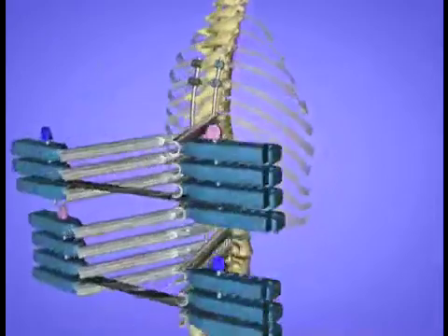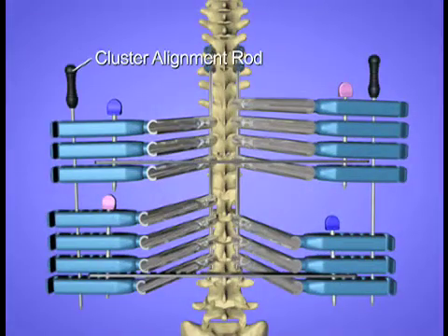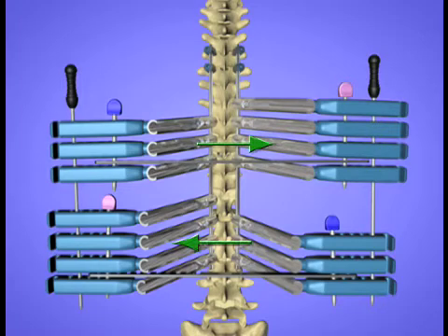With desired axial plane correction achieved, cluster alignment rods are added to hold the correction in place. Holding a slight overcorrection will account for elastic rebound in the construct when instruments are removed.